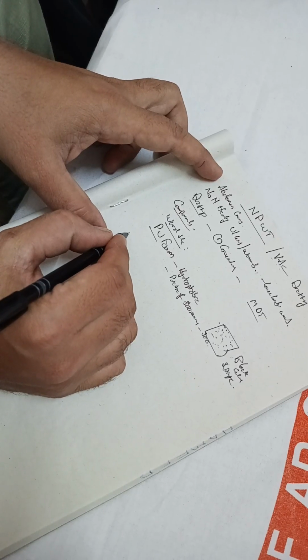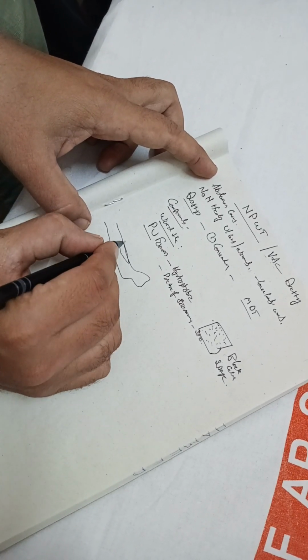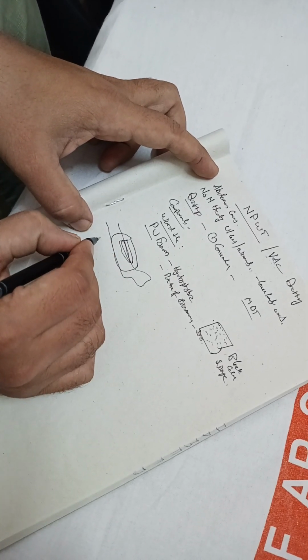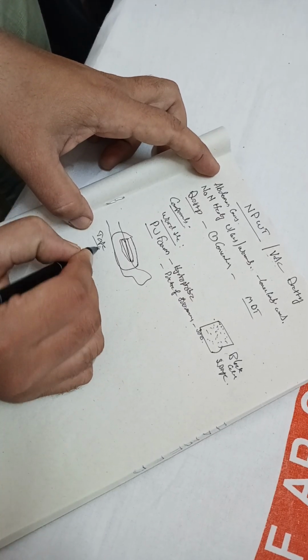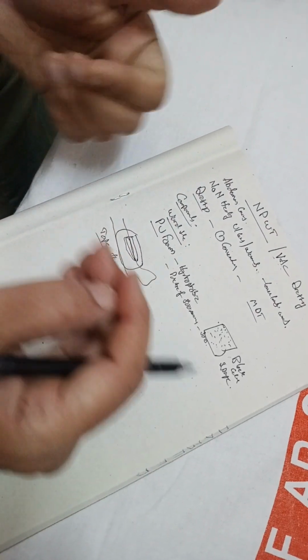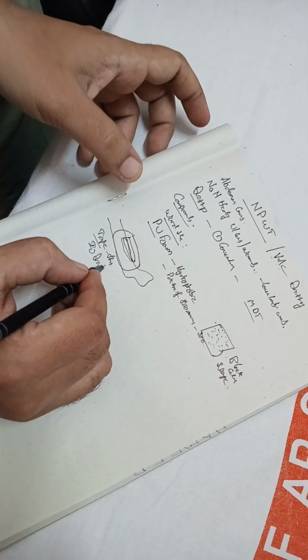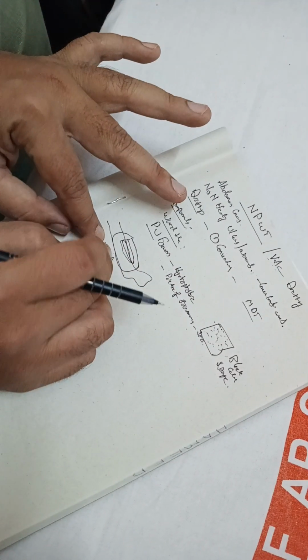So what we do is, this is a limb, you have a wound here, so we apply the foam here, and then we will seal it with tape, nothing but tape, very thin tape, like a plaster, transparent, or we can use IO drape. In CTVS they use IO drape, in surgery they use IO drape. So the main concept is that it has to be sealed.